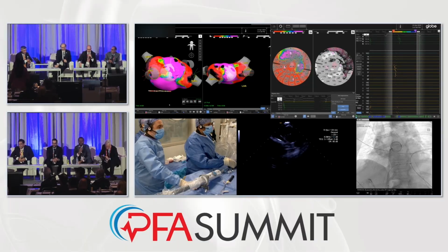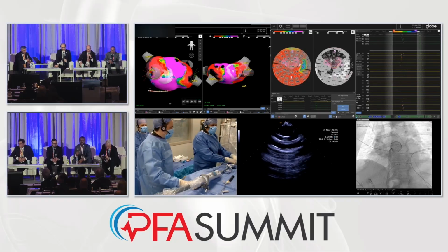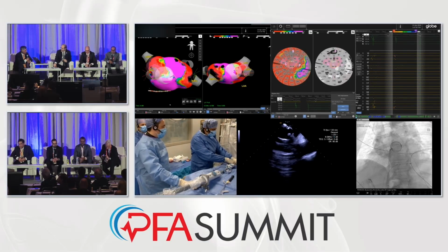Srini, what are you going to do with the vascular access? Do you pre-close, figure eight, or what do you do? Yeah, pre-close. No, pre-close.